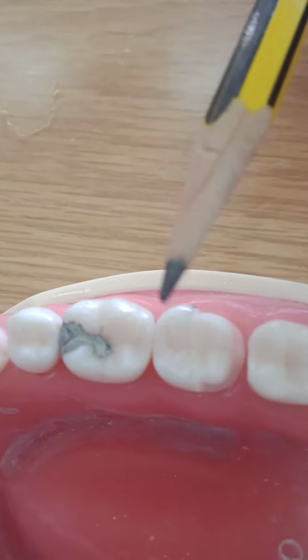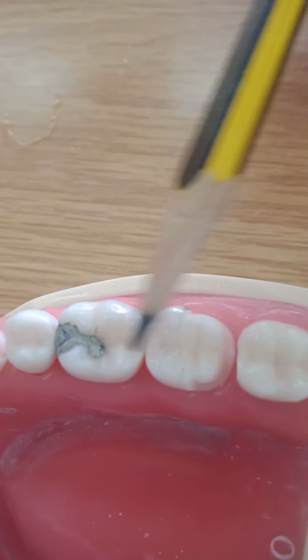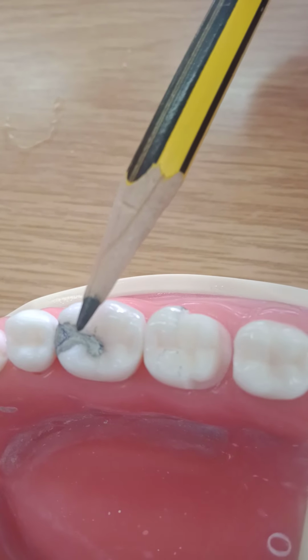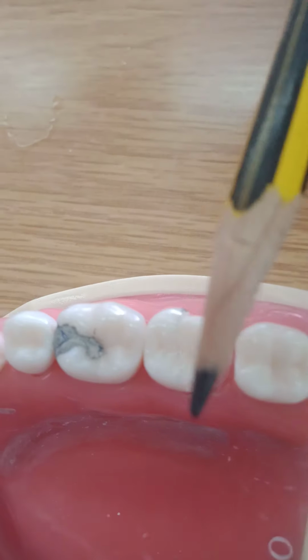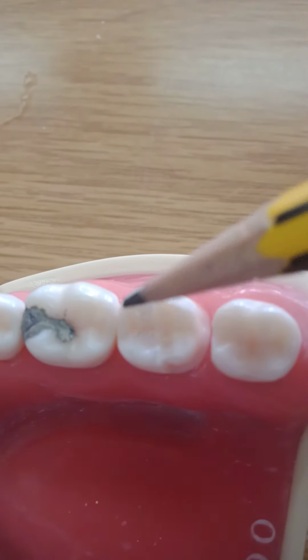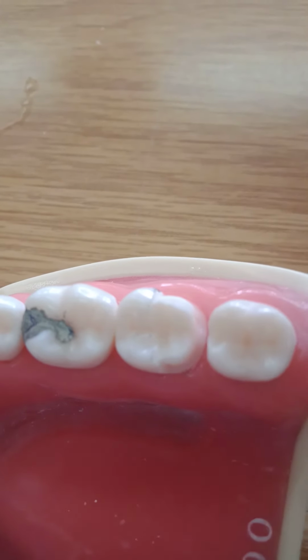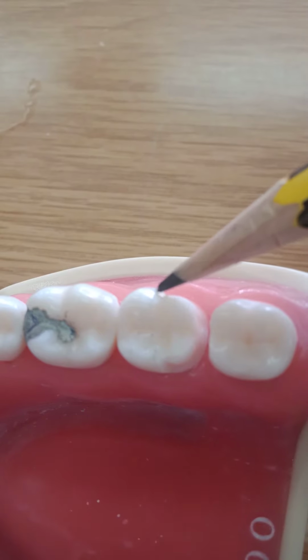Now, this is just for practice. But the idea is that we keep the distal because usually we want the retainer to retain a missing tooth anteriorly. Sometimes the tooth is a bit tilted, so we prepare the mesial and leave the distal. But since this is just for practice, you have the option of keeping the mesial or distal.